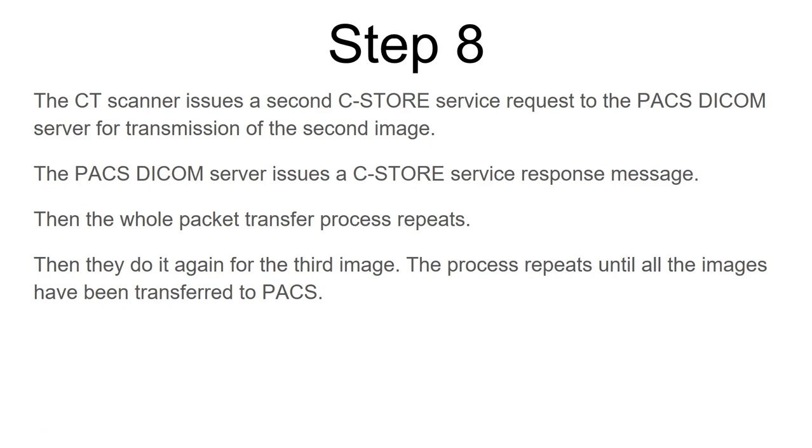So when we say DICOM connections are slow, it's because of all of this process of talking back and forth and moving all these packets to create whole images. That's why a DICOM connection is slow. That's why when people click on a link that brings up a DICOM image, we're not just pulling a JPEG quickly across the TCP/IP connection. We're pulling it through a DICOM connection. All of this discussion has to go back and forth between the workstation and PACS to pull it out, or between the CT scanner and the PACS to get the images in.